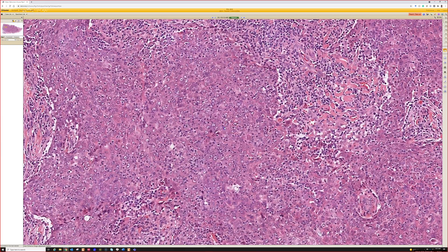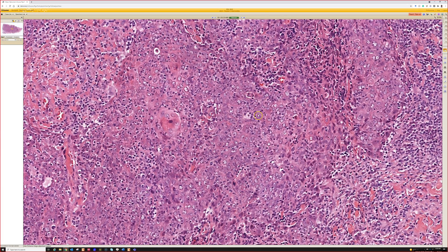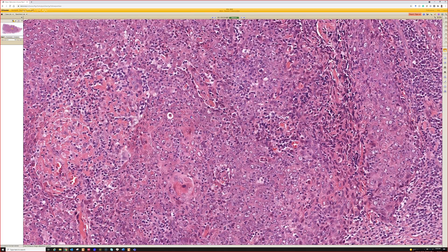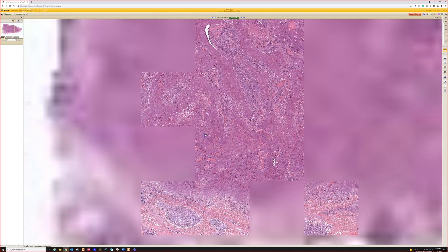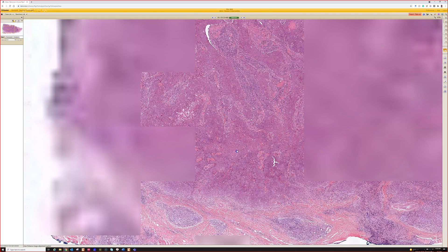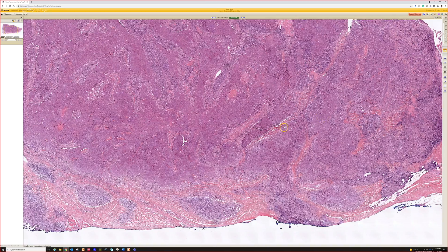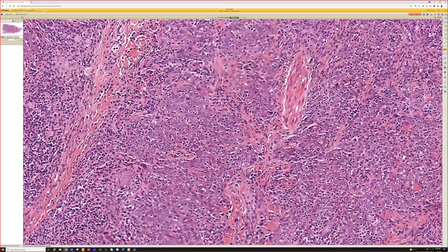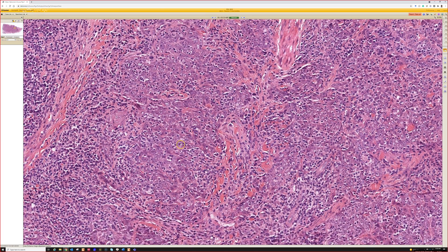In the skin, that is not the case as far as I understand. But lymphocytes surrounding the nest and infiltrating the nests — here we've got lymphocytes peppering into the nests of tumor cells. From low power, this thing is basically an ugly poorly differentiated carcinoma swimming in a sea of lymphocytes. I also feel like the cytology of these cells has a very characteristic look that's different from most squames.